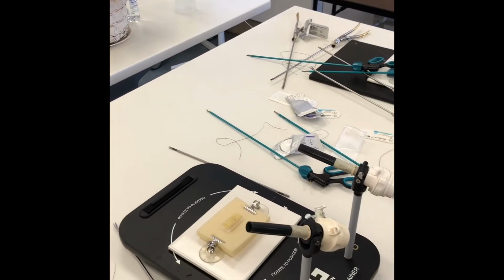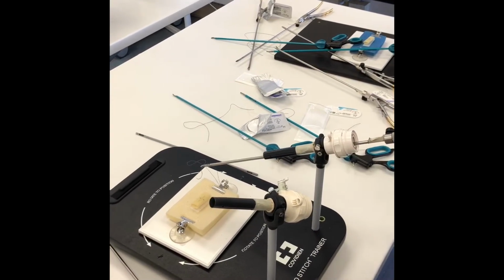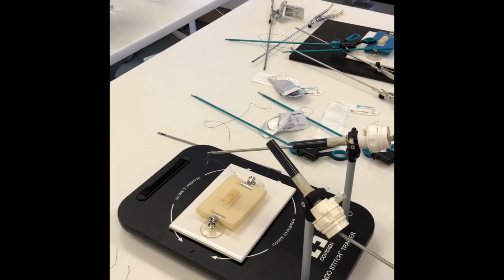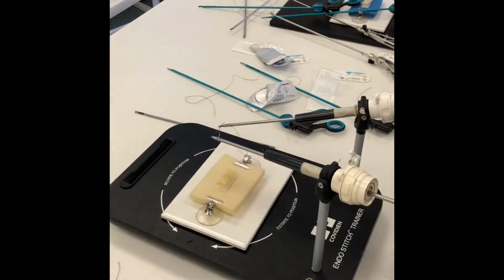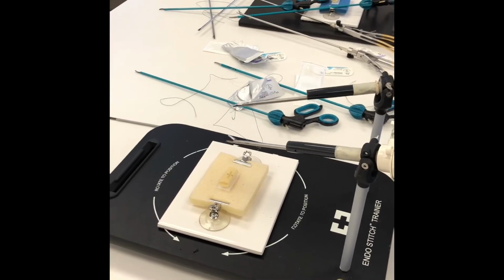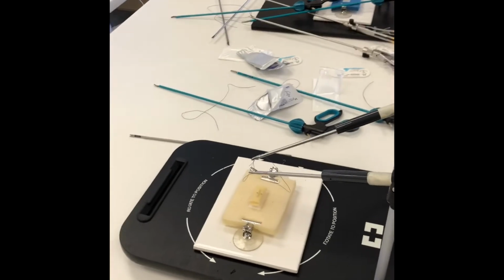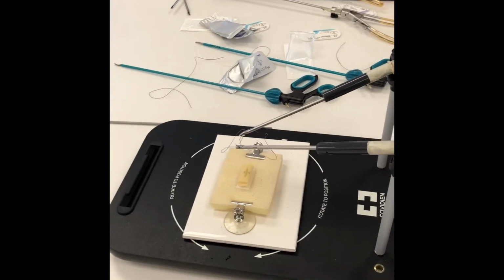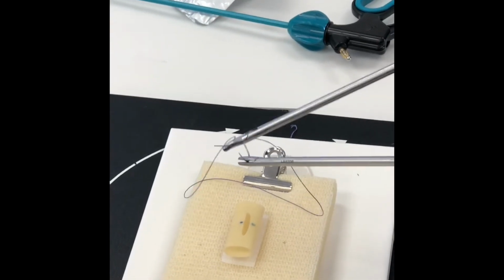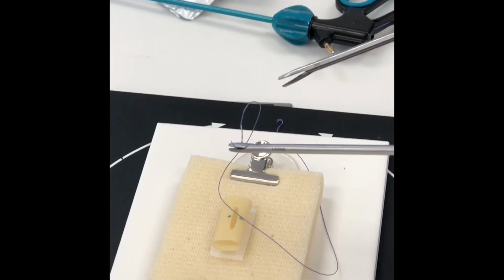Okay. Now I'm going to bring it in with my right hand. It's still in the right orientation, ready for me to load. I bring in my other needle driver. Now, I always grab one-third from the tip. My other hand is now ready to adjust my needle with my suture. And then once I get the right angle that I think is good, I let go of the suture and I re-grasp.